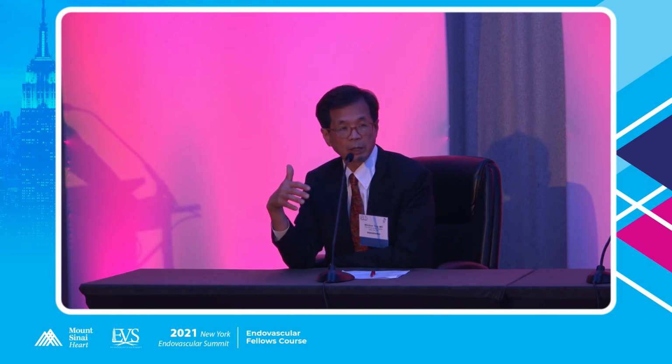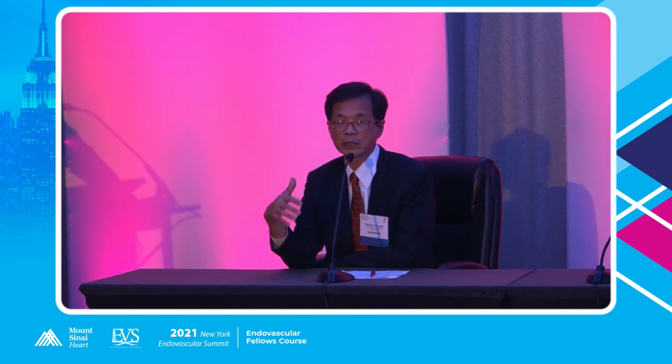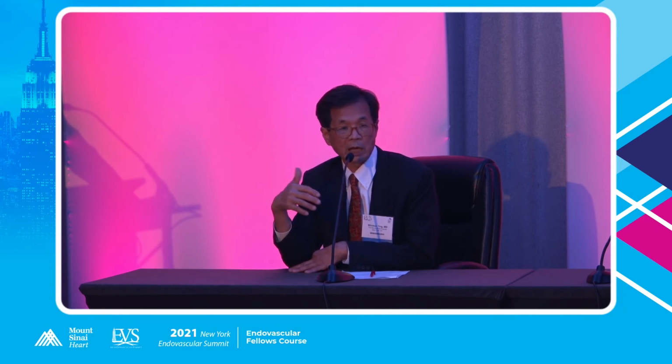When a patient develops symptomatic PE, usually it's a major PE. It's a major clot. If you can look at the clot, it's probably tremendous. So when you're dealing with a small thrombus, probably it's not a concern. So, I would say in the last 2-3 years, I stopped putting filters in these patients, and I have not so far encountered a problem.